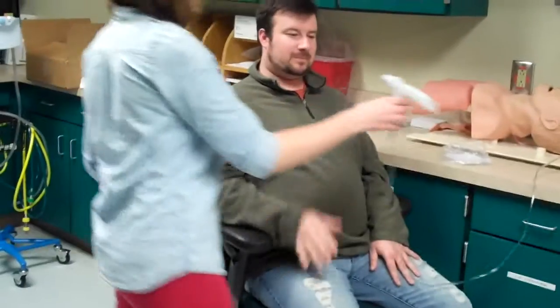Ready? Deep, deep, deep. Hold it, hold it, hold it. And let it out. Good job. Still doing alright? Yeah? Okay. It stopped misting completely. Alright, let's see that. How you feeling? Good, good.